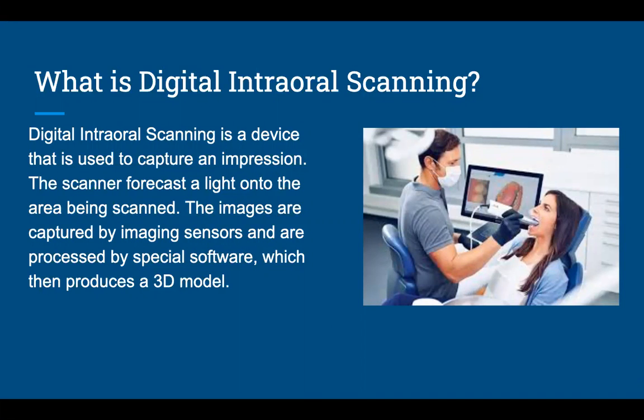Yes, and in addition to that, like Taylor was saying, the 3D model is great for patient record keeping, which is a fundamental aspect of dentistry because you want the patient to have comprehensive care. Accurate information entails invaluable data of medical records, diagnostic information, similar to radiographic images. You want that to help with treatment planning and the doctor to diagnose thoroughly and properly.